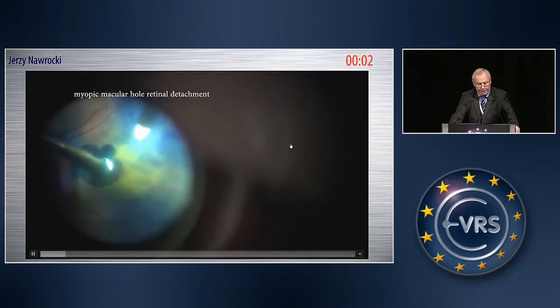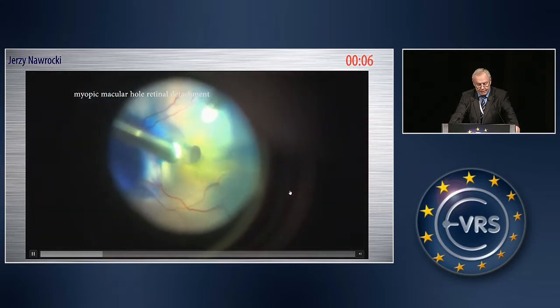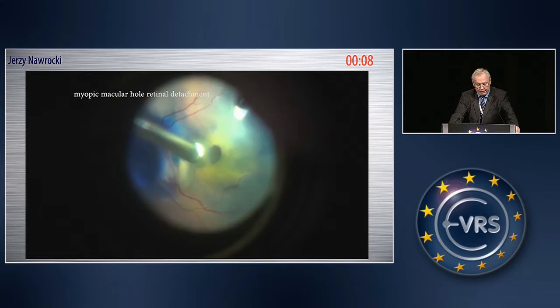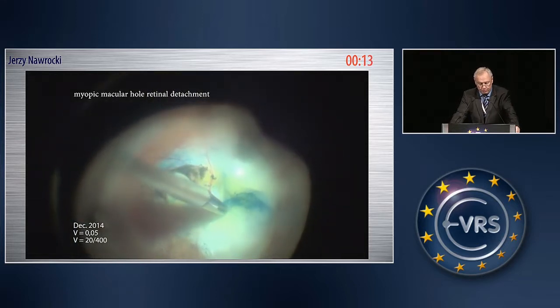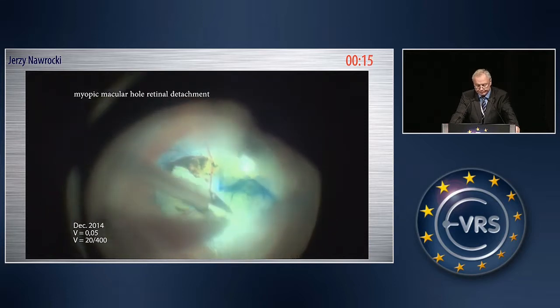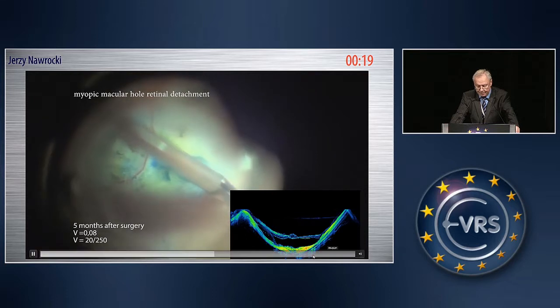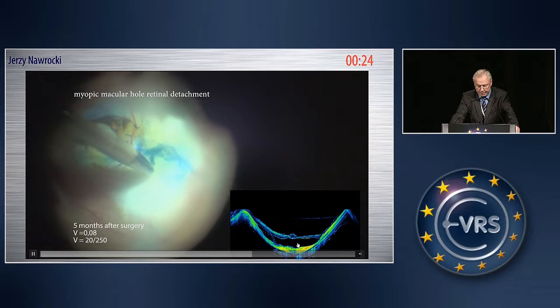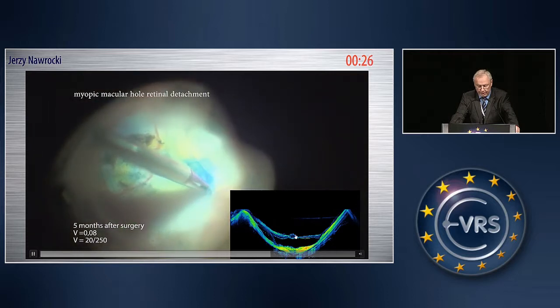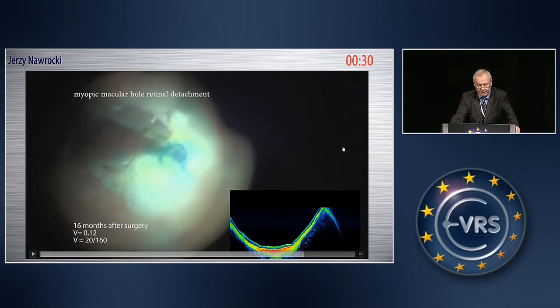Another example is myopic macular hole retinal detachment. In these cases, I usually try to begin by removing some subretinal fluid through the hole, but without touching the hole, and then cover the macular hole with the inverted flap. In the early postoperative period, we may see some presence of fluid, even if the macular hole is closed, but this may disappear over time.